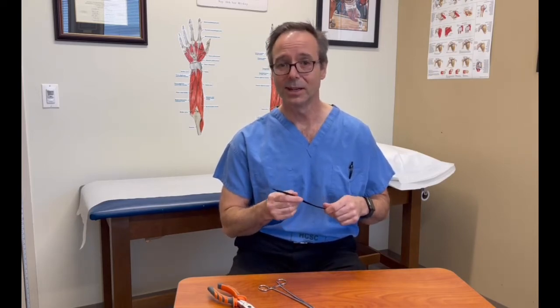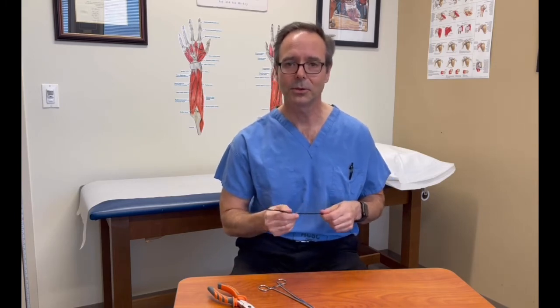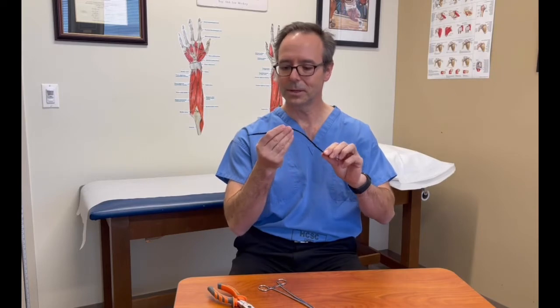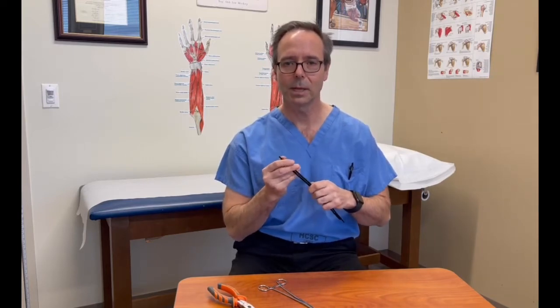Today we're going to discuss how we use the hook splint as a relative motion orthosis and how we apply it and lock it. When you first get it, it's going to come out of the package and you'll ask yourself, oh, how am I going to use it? How am I going to use these tabs to apply the locking mechanism?